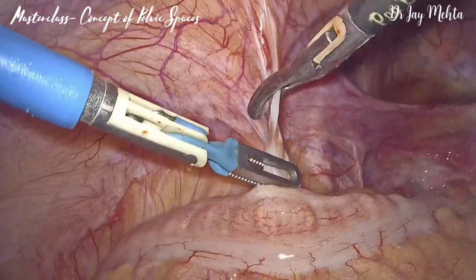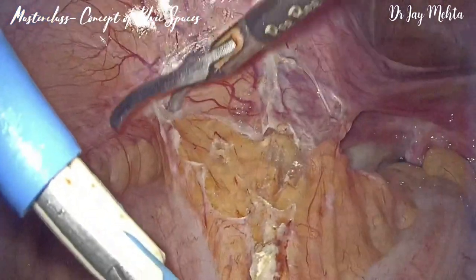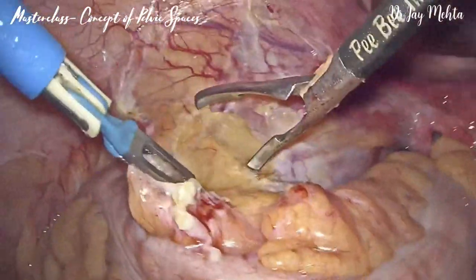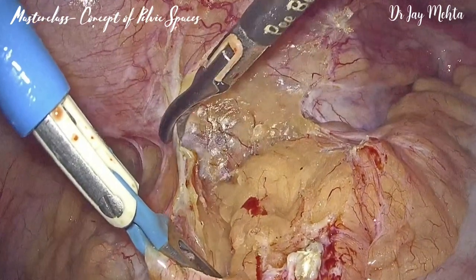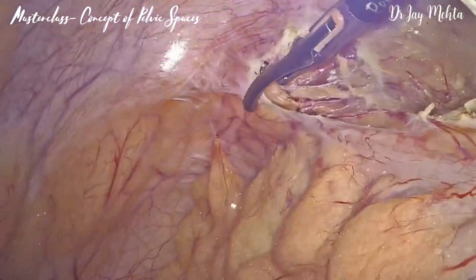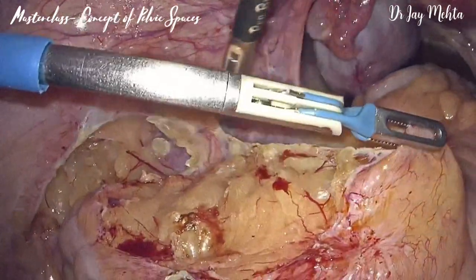The video which follows this presentation is a live video from a patient where we have dissected open the pelvic spaces, especially the pararectal space and the paravesical space. We begin with mobilization of the sigmoid. These congenital adhesions of the sigmoid will keep causing the bowel to come inside the pelvis and hinder your view. So first and foremost, the sigmoid and its adhesions have to be taken out of the pelvis. I like to mobilize the sigmoid for approximately 5 centimeters, and then we begin the dissection of the pelvic space.